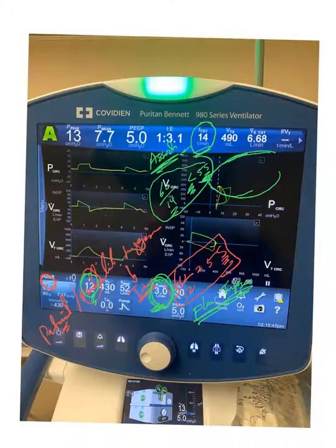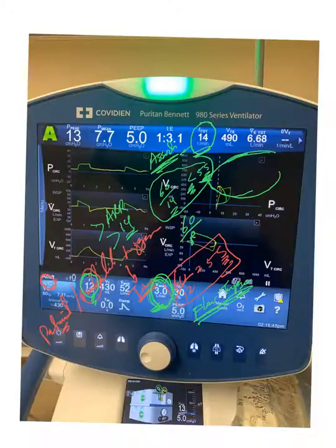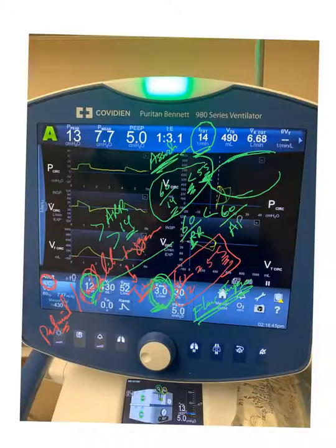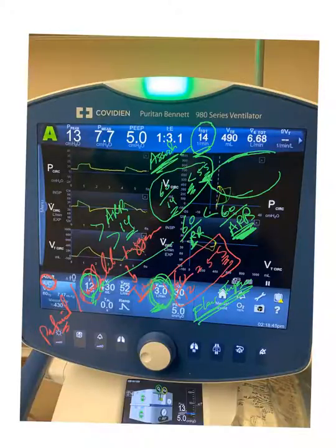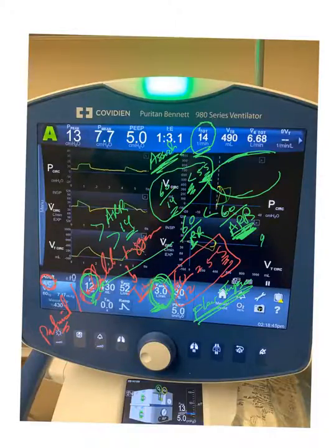So changing the set rate will only work if you increase it above the actual respiratory rate — more than 14. That means making 60 divided by the set rate less than 60 divided by the actual rate. For example, if you need the patient to wash out more CO2, pay attention to this. I often see a patient already breathing at 20 and the set rate at 12, and someone increases the ventilator rate to 14 — it's not going to work. That's how you identify the trigger: this is a flow trigger, and all these are assist breaths.